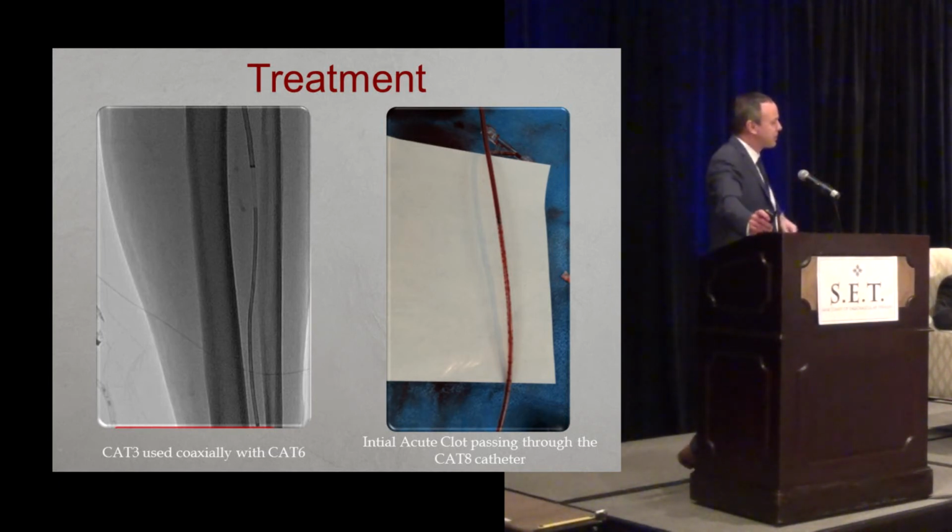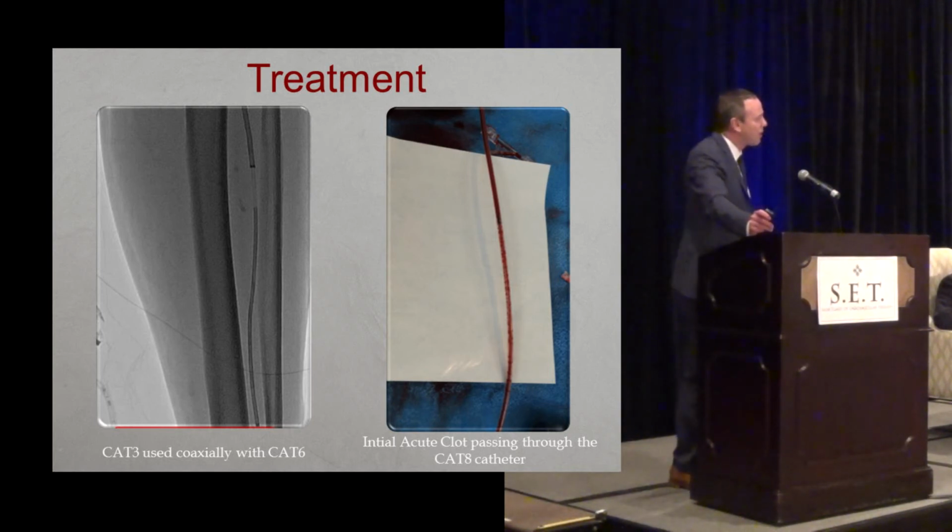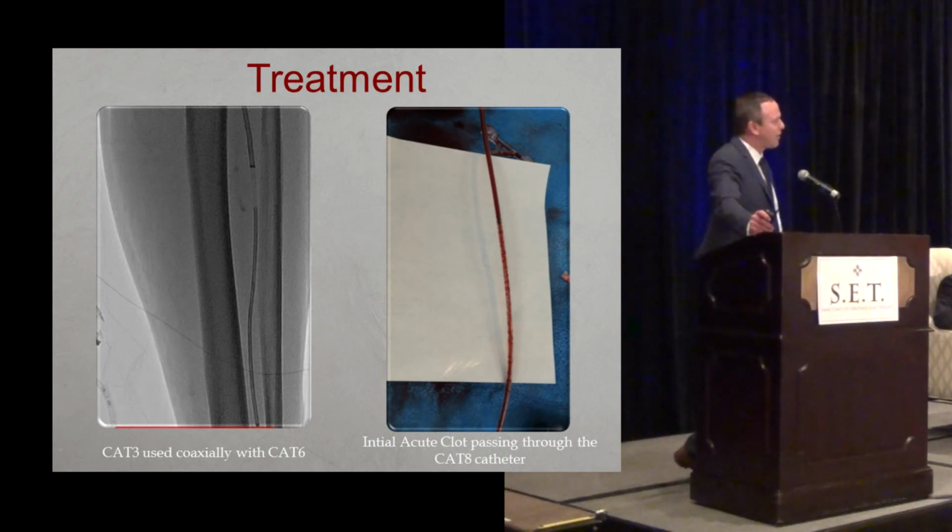So those are the popliteal stents. But you can see flow through there is relatively slow and stagnant, and the reason for it is because I just have the single vessel runoff. We then proceeded to get another vessel runoff of the anterior tibial over there and got that. He actually did quite well, was discharged home 3 days later without fasciotomies and did relatively well.